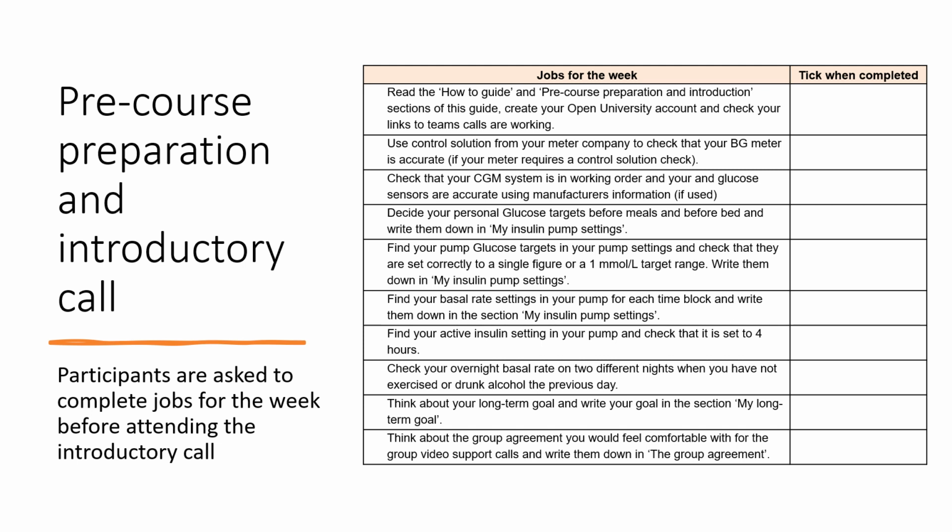And they can find the pump settings they may need to adjust, set the insulin action time in their pump to 4 hours. Participants are asked to decide on their personal glucose targets and set an appropriate glucose target in their pump. DAFNE glucose targets are included in week 1. Participants use their pump as usual and begin the process of basal rate checking overnight and thinking about their long-term goals and the group agreement before accessing the course.